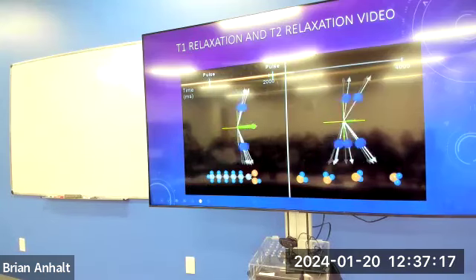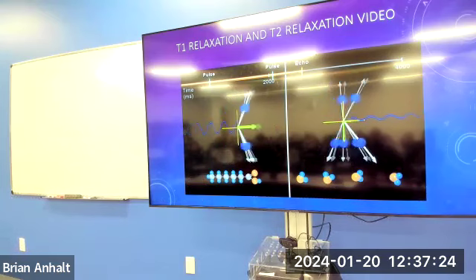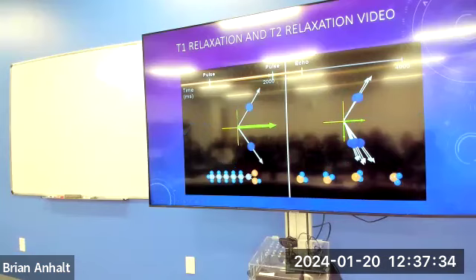This configuration in the water protons will give a low amplitude or low energy wave when we listen for the echo or return signal. In other words, the protons in the water are saturated with energy and can no longer produce a strong transverse magnetization. Therefore, to accentuate the differences in the T1 relaxations between the protons in fat and water, we want to rapidly put in our resonant radio frequency pulses or a short repetition time, TR, and quickly listen for the return signal or short echo time, TE.